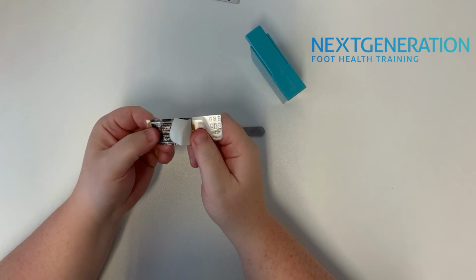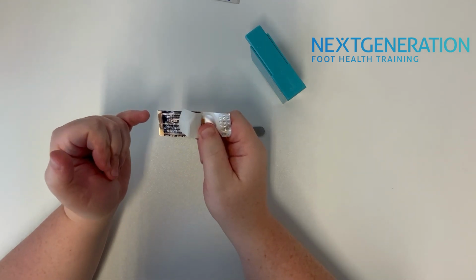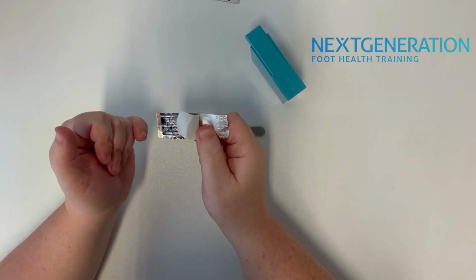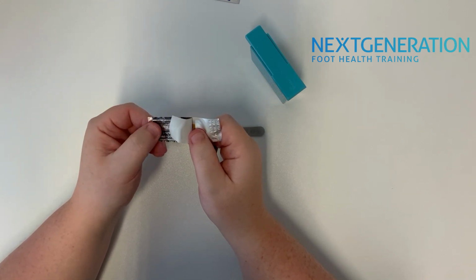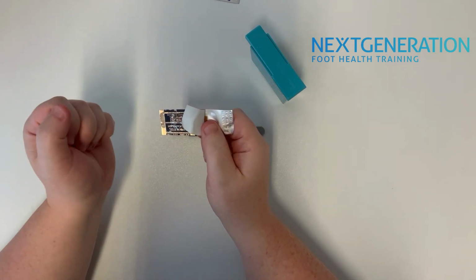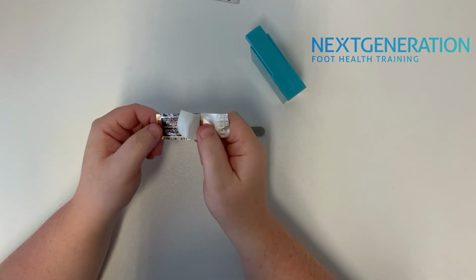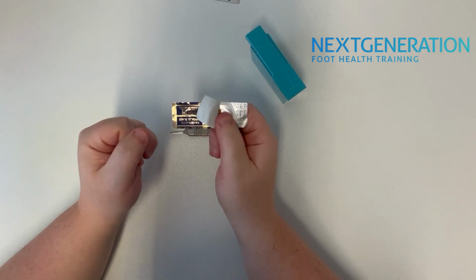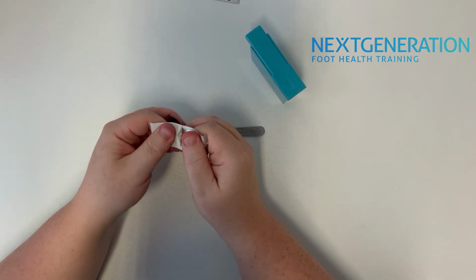So when you open the packet, open it very slowly. Now, it's foil packaging, and it's quite thick foil packaging, but these blades are so sharp that that blade will pierce that foil packaging if we're not careful. Sometimes people can put them on incorrectly, and if they put too much force whilst trying to apply it to the handle piece, that blade can pierce that foil packaging, and there's only one place it's going to go, which is probably the palm of your hand. So very carefully unwrap it.